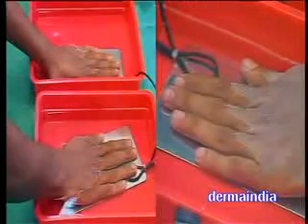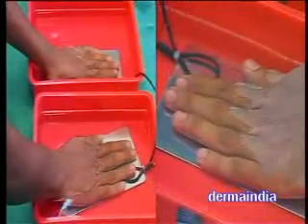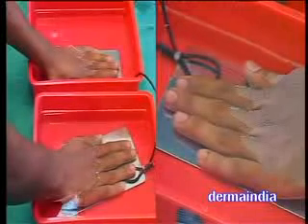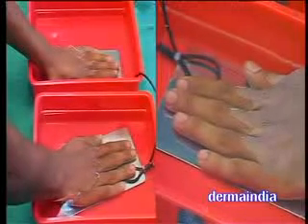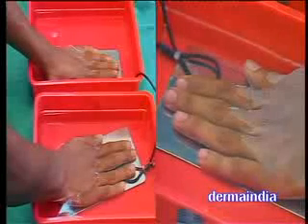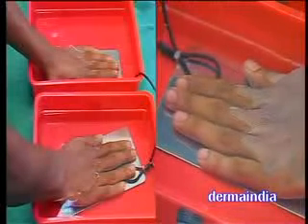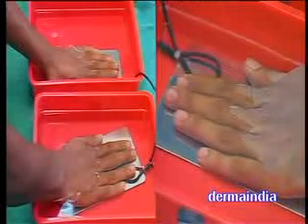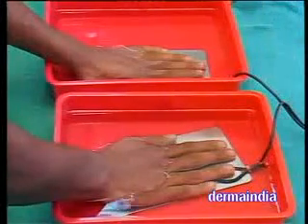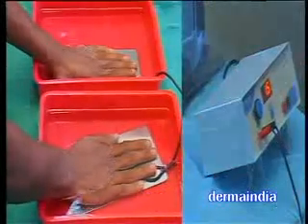In the same way, an iontophoresis roller can be used for axillary hyperhidrosis. For axillary hyperhidrosis, you use a plain roller. For axillary bromhidrosis, apply a topical antibiotic and topical antifungal. Mix them and apply to the axilla and use this roller. 10 minutes for one axilla.